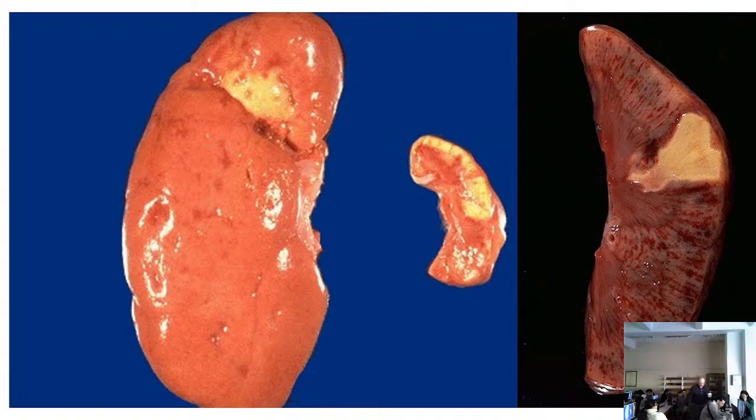Is it common that these patients also have an embolism somewhere else? I cannot understand the mechanism because if an embolus arrives and blocks the renal artery, the right image will appear. What is that? An infarct. You see? This is the result of infarction in the renal artery. On the left image, we have chronic ischemia. So we have atrophy, not enough blood supply, and nephrogenic hypertension.